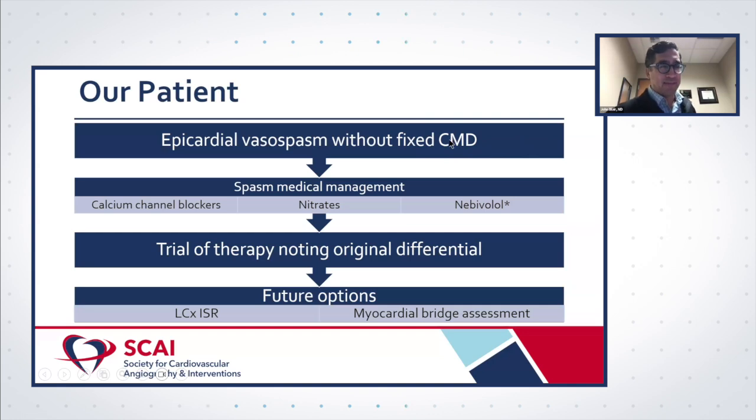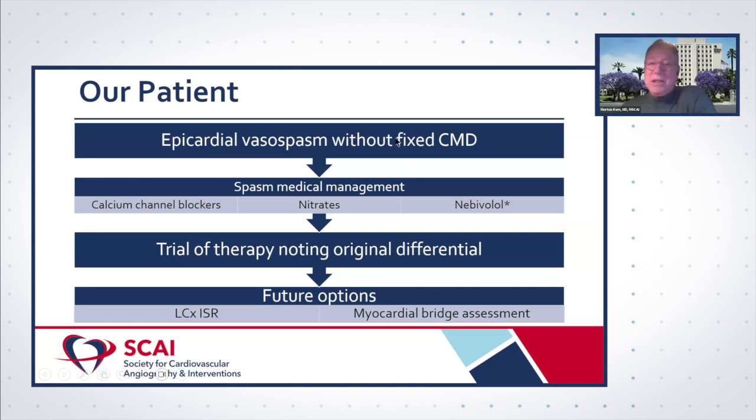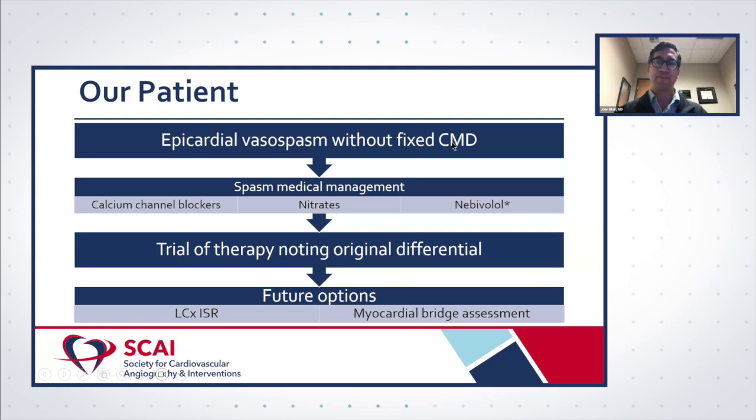Right. Okay. This is just kind of how we've come about writing these in our reports to convey the information properly, but since, as you pointed out, maybe that's confusing, how would you say it? I would just say exactly what you found, that there is evidence of epicardial vasomotion, vasospasm, and that the coronary microvascular circulation is normal.